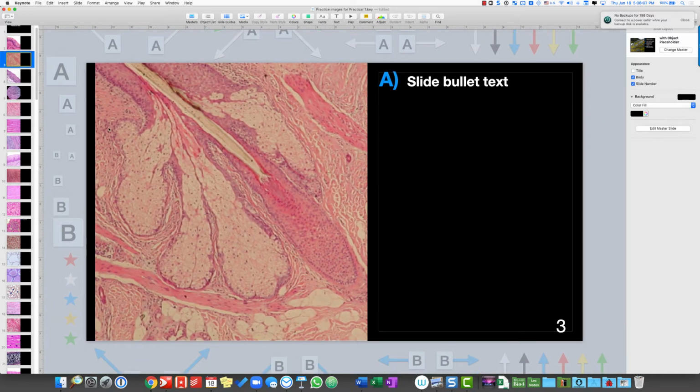This one has got a number of things in there. This is the hair follicle. You can see the epithelial tissue here. These are the sebaceous glands that are associated with the hair follicle. This is the arrector pili, and here we can see the dense irregular connective tissue with the collagen and the fibroblasts in there.